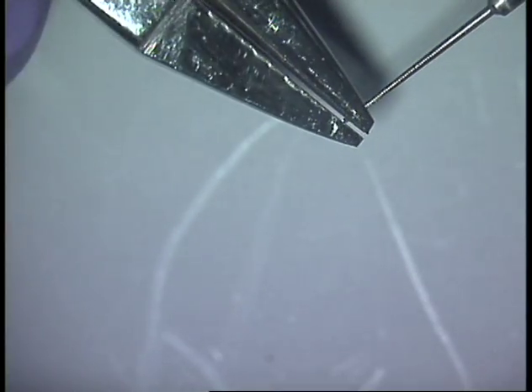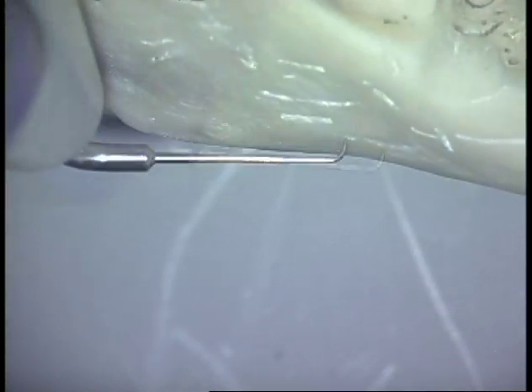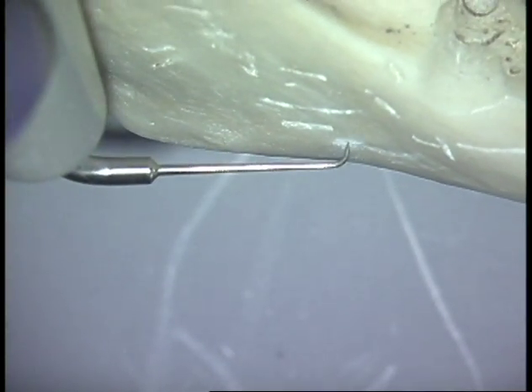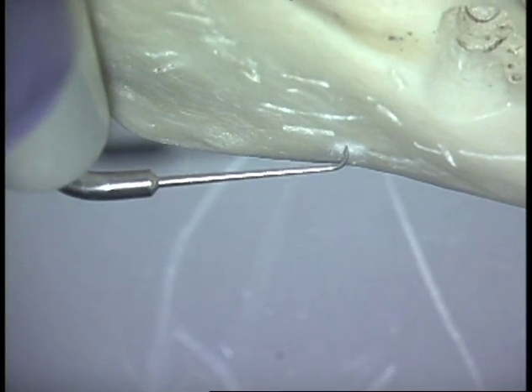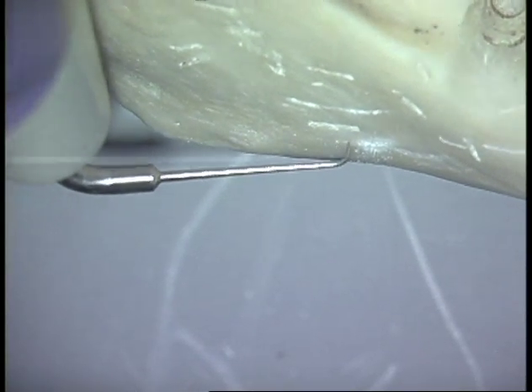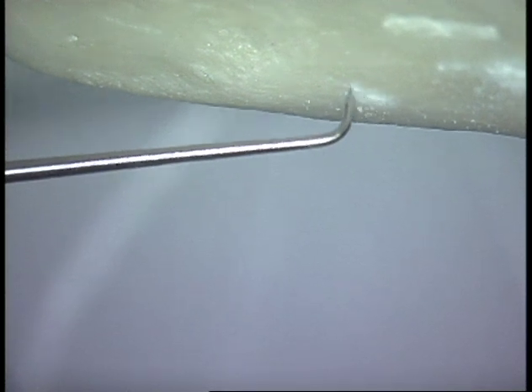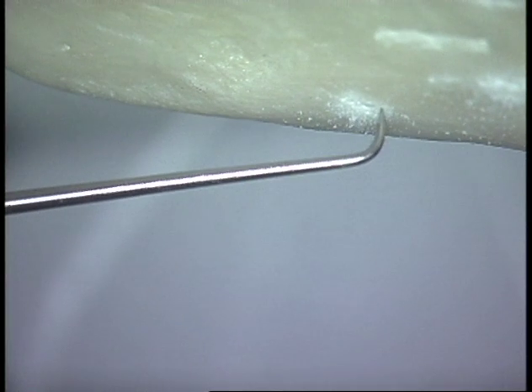This is a UT4, or Slim Jim 4 — same situation. If you want to have a tip that is very light cutting to start the prep out with, it's very easy to do with these tips. Here you can see how gentle that cutting action is.